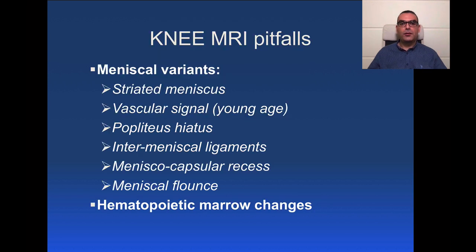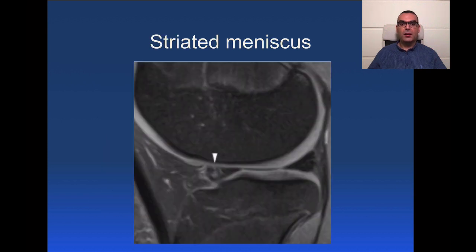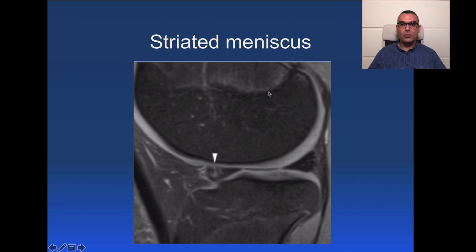First, let's review some of the common MRI pitfalls — normal variants that should not be mistaken for pathological changes. Number one is the striated meniscus. This is a normal striation, a normal striated hyperintense signal, seen at the anterior horn of the lateral meniscus. This is very common at young age, and you can notice the epiphysis is not yet fused. This is the normal meniscal striation.